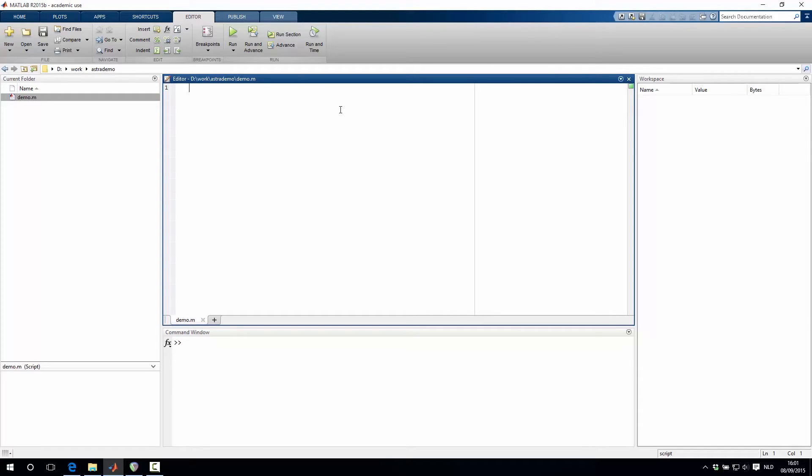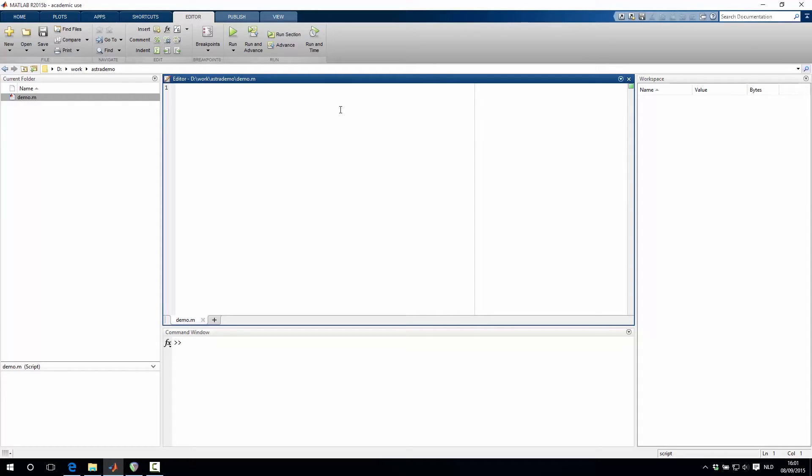We'll do this by creating a phantom image, projecting that phantom image into a sinogram, and then reconstructing that sinogram with the FBP method. We'll do this first with the CPU version of the algorithm, and secondly, we'll also do this with the GPU accelerated implementation that is provided by the Astro toolbox.